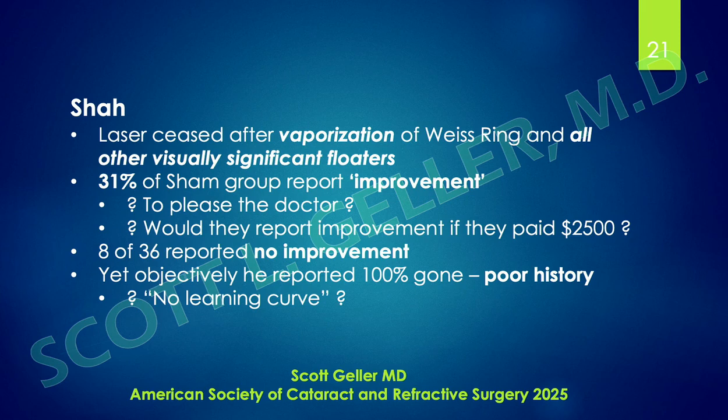8 of the 36 treatment patients reported no improvement. Yet Dr. Shah objectively reported 100% of the, I assume, Weiss-type opacities were gone.